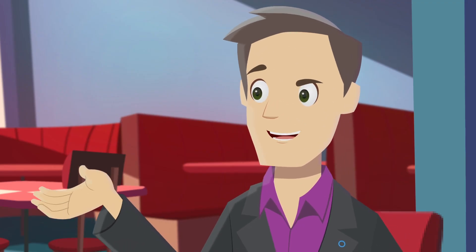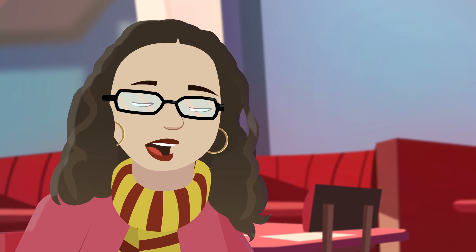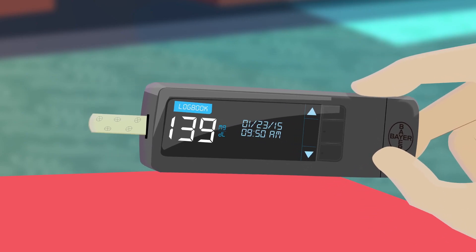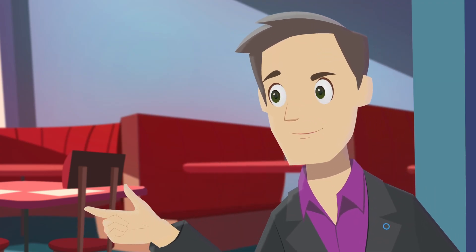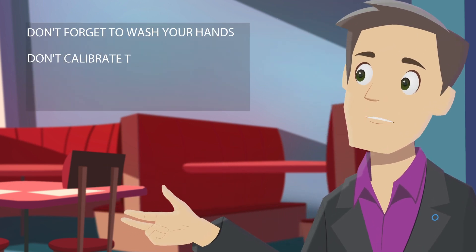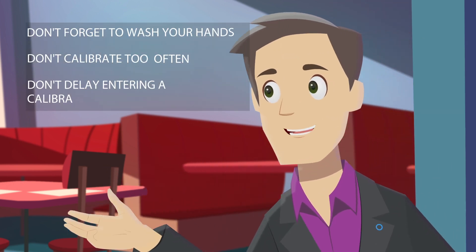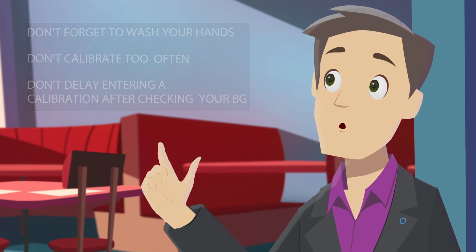You should always try to wash your hands before taking a finger stick. But later, I checked my sensor and it hadn't adjusted, so I took another finger stick, put my supplies away, and then entered it 10 minutes later. It sounds like you didn't wash your hands, you calibrated too often, and you delayed entering the last reading. These actions can confuse the sensor, causing inaccuracy.